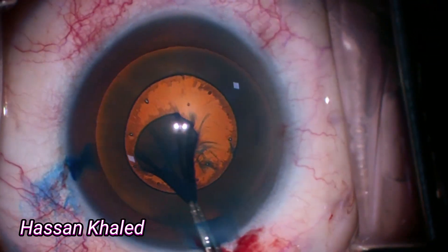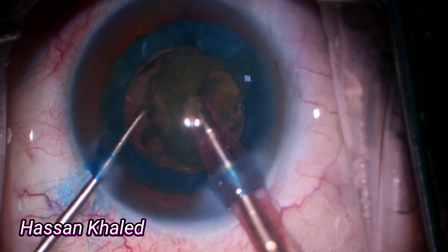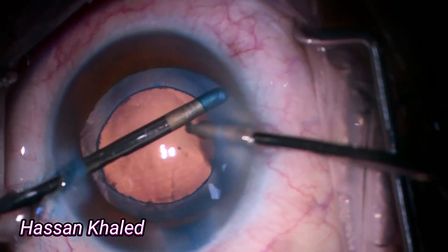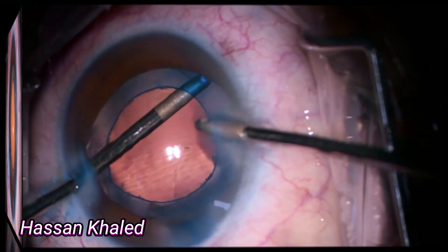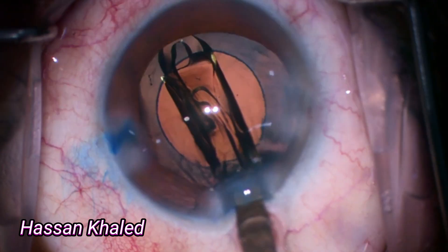Now removing the rhexis — you can also see the Purkinje image in the center of the capsulorrhexis. Then applying phacoemulsification as usual, followed by cortex removal, washing, and polishing the anterior capsule. It is very clear. Now it's time for implanting a single-piece hydrophobic IOL inside the capsular bag.